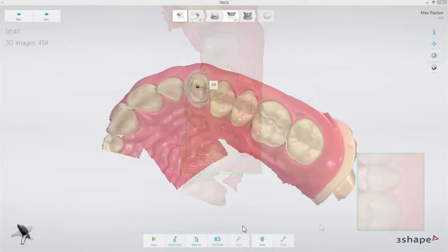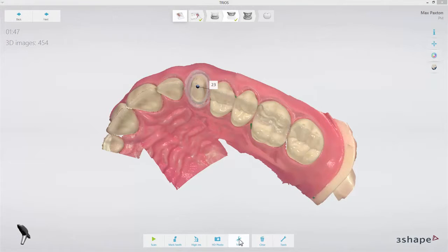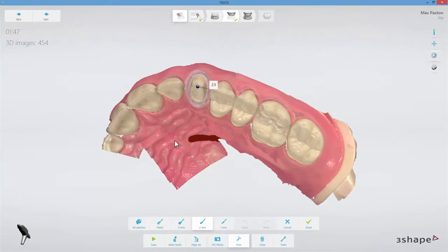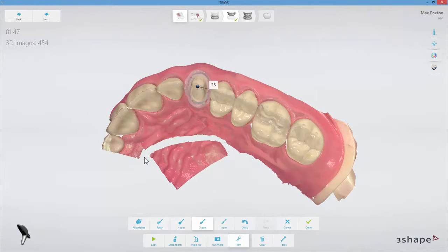Now to the Trim tool. Trim is used to remove areas that you don't wish to have in your scan. We recommend trimming larger soft tissue areas, tongue and fingers away completely.